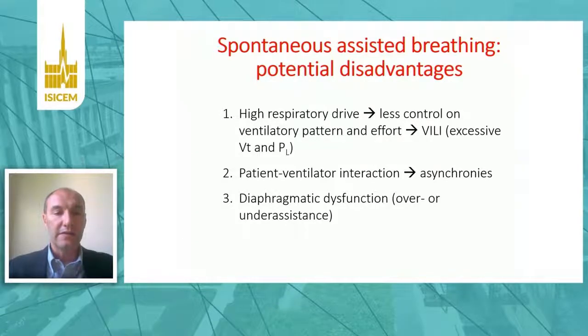There's the problem of bad synchrony between the patient and the ventilator, so the risk of asynchronies, and also the risk of diaphragmatic dysfunction, which can be linked both to over and under assistance. So it is extremely important to monitor the patients to avoid all these potential problems.